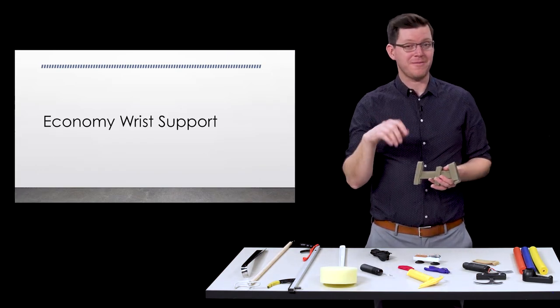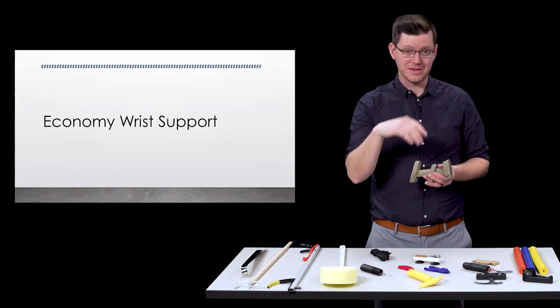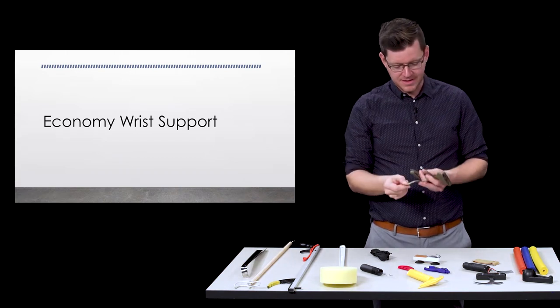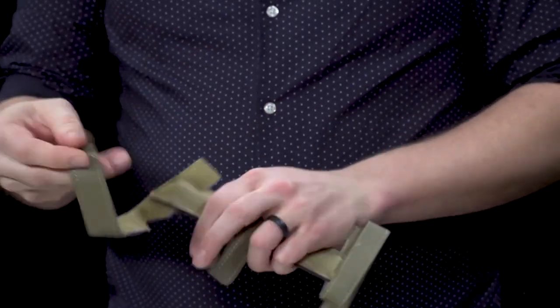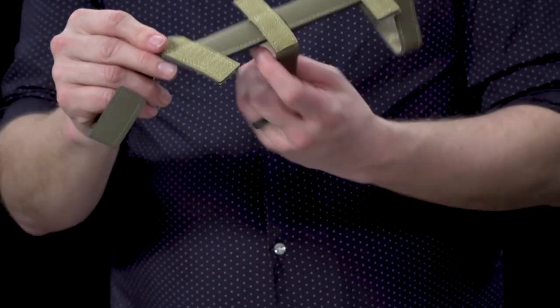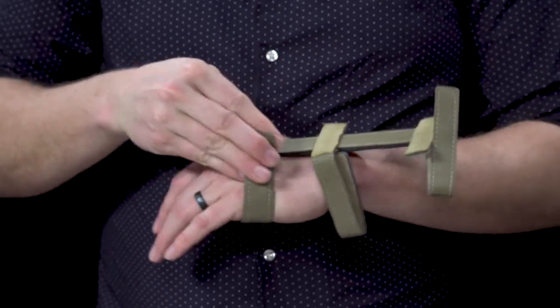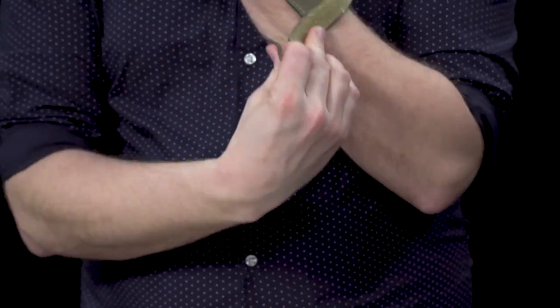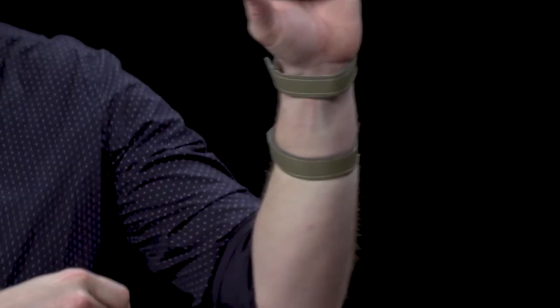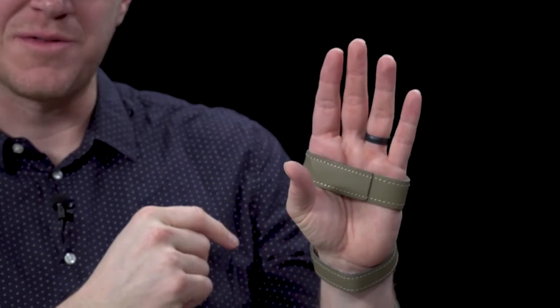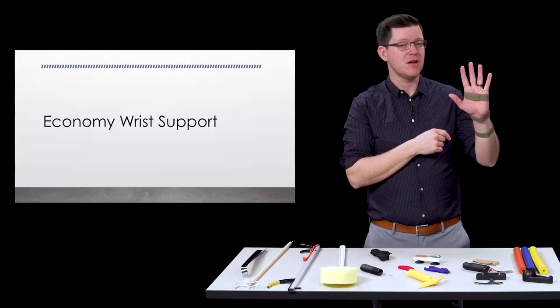One of my favorite tools for people who have some weak wrist, especially in the wrist extension which is pretty common, are using these economy wrist supports. So what we do is we put the bar over the top of our hand and put it on like so, and then we can adjust the spine here to be the angle that we want to keep our wrist.